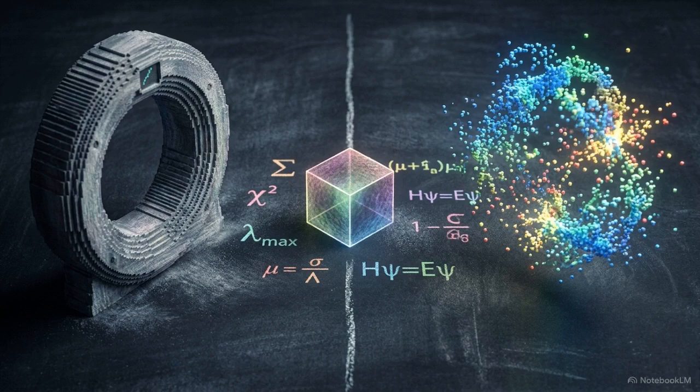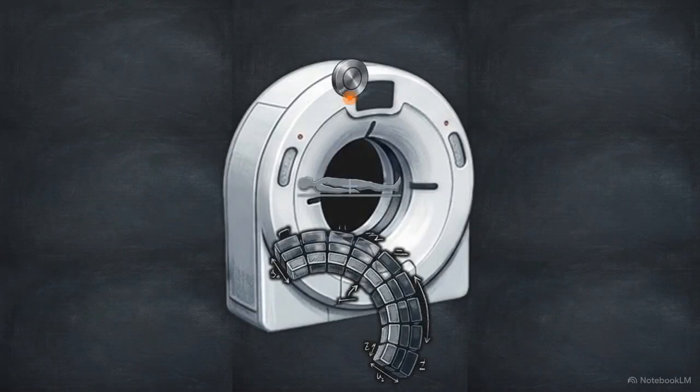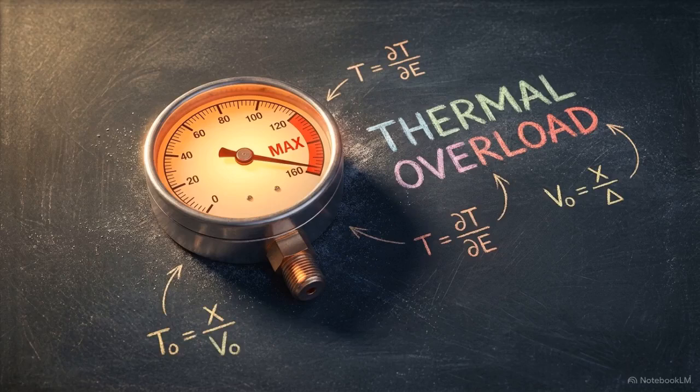that microscopic cube. Inside the CT gantry, the transaxial plane is captured as the X-ray beam originates from a focal spot, projecting through the patient to strike a curved detector array. The physical size of this focal spot sets a hard baseline for maximum spatial resolution, but an intense stream of electrons hitting a tiny focal spot generates massive heat. Using the fine spot severely limits the maximum tube current safely applied before causing thermal damage to the anode.